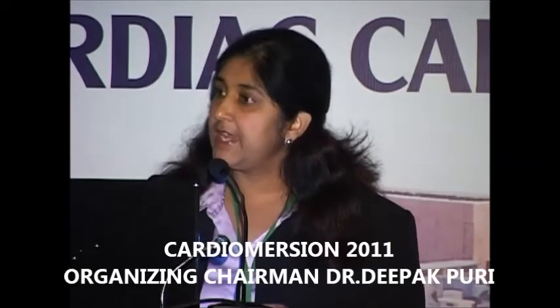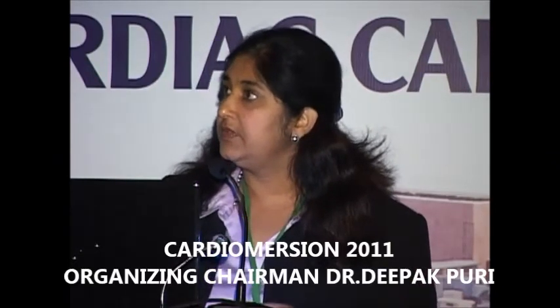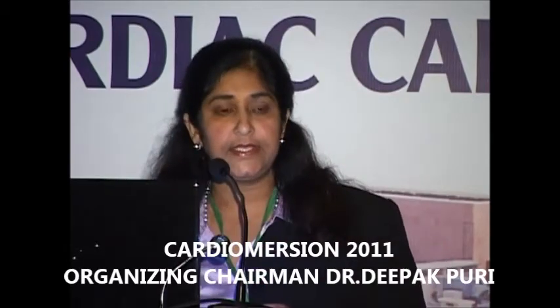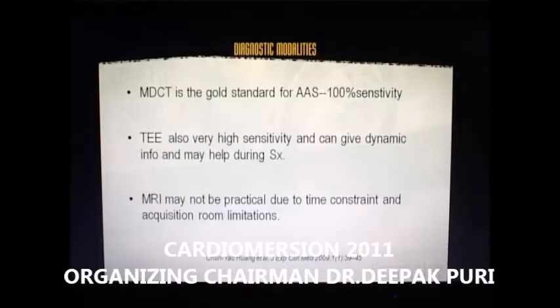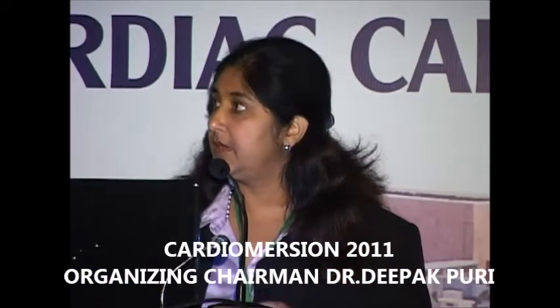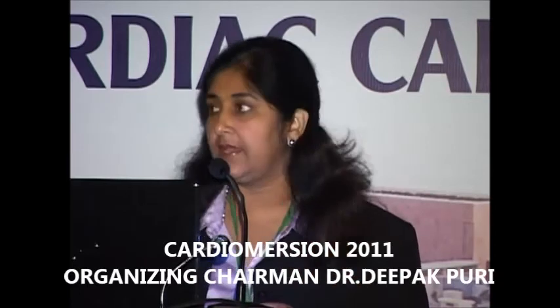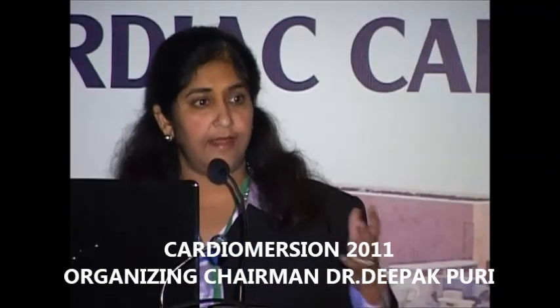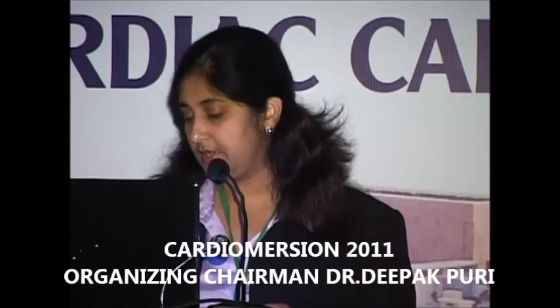This is a rather busy slide, so I will head on to the next one, where we will talk about the diagnostic modalities a little more. MDCT has now come to be the gold standard for acute aortic syndrome with almost 100% sensitivity. TEE is, as I said, also highly sensitive, and it can also give dynamic information. MR is not practical because of time constraints. MR takes a much longer time, and we probably do not have that much time in an acute aortic syndrome setting.